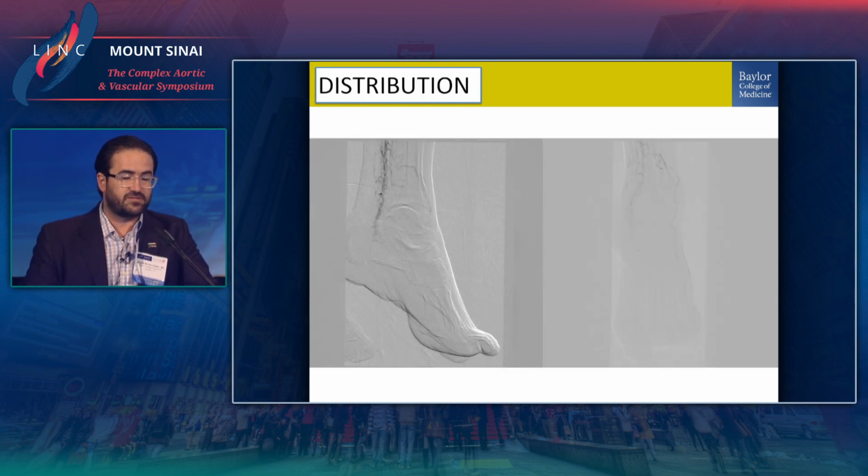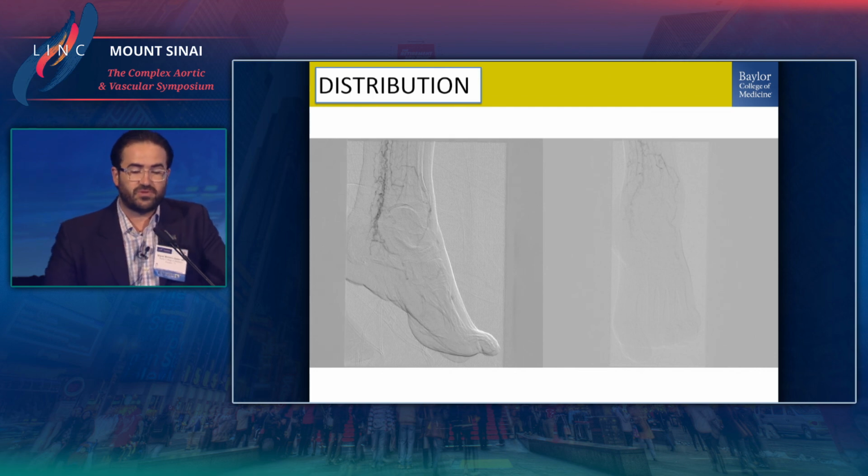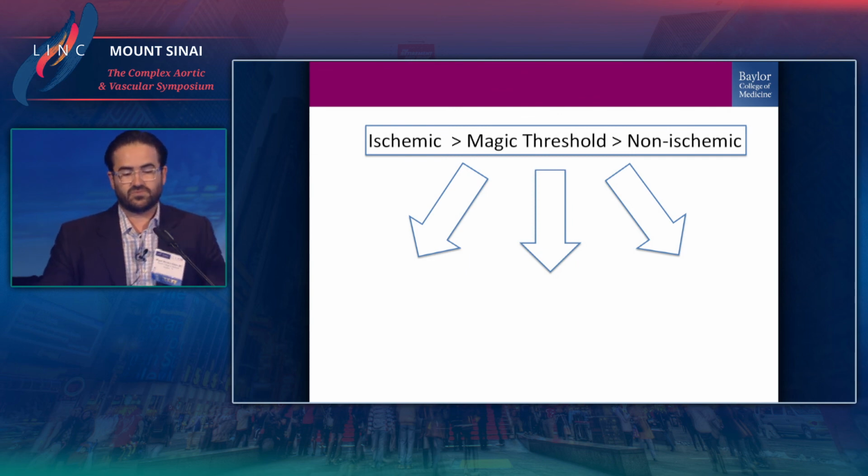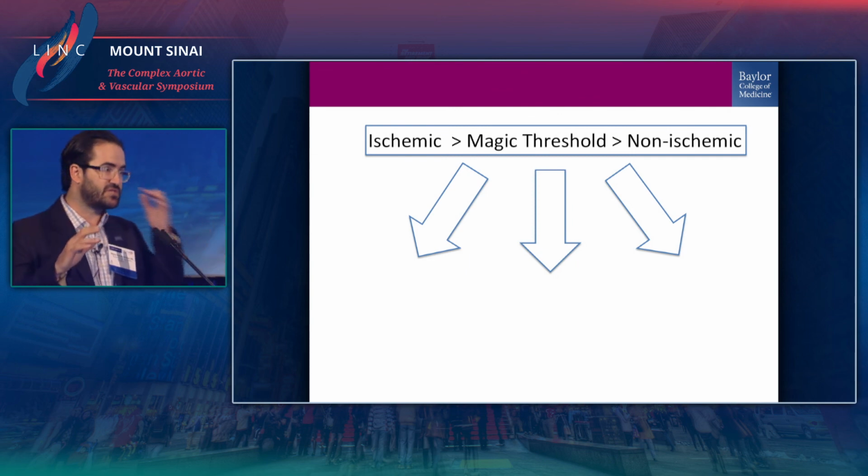On the other hand, this person has some flow all the way down to the ankle, but then it stops, and then all you have is all these squiggly vessels all over the place, and you really don't know if they end up going somewhere or if they're effective in the way that they transport. So there seems to be a problem called ischemia.